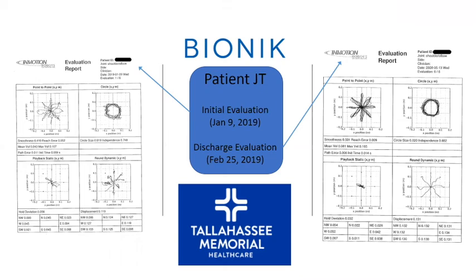The nice thing about the device is the fact that it has two different ways that you can actually pull reports off of it. But the big thing is we always want to make sure that we tell everybody, before you do either one of these, check with your IT department and make sure that it's permitted in your facility. We don't want to be getting anybody in trouble. So the big thing here is you can print them out, and then those reports can easily be scanned into the medical record pretty directly.